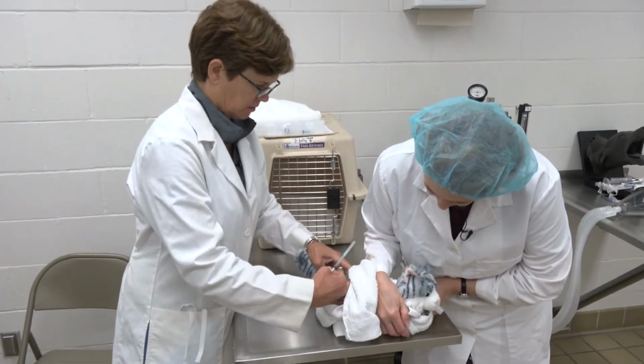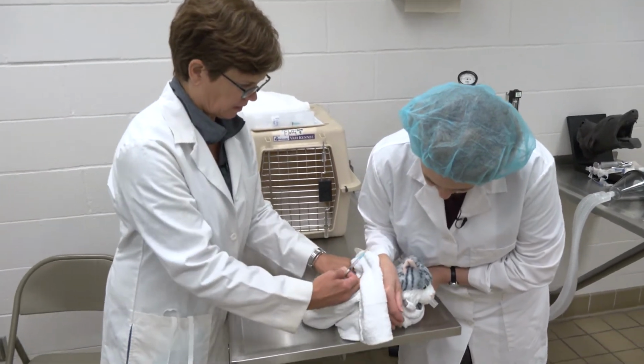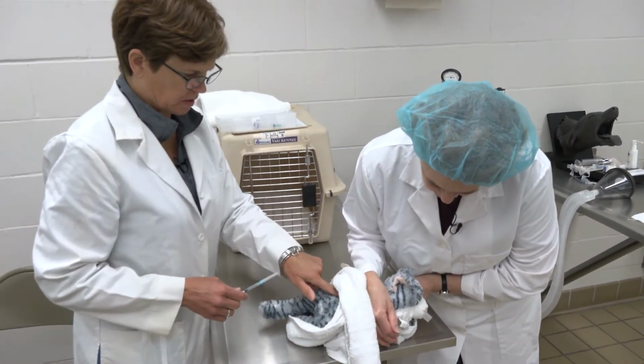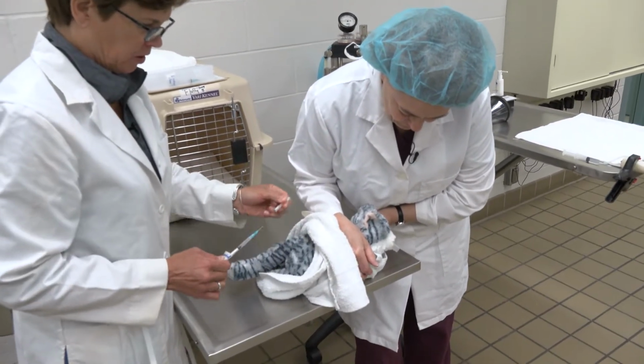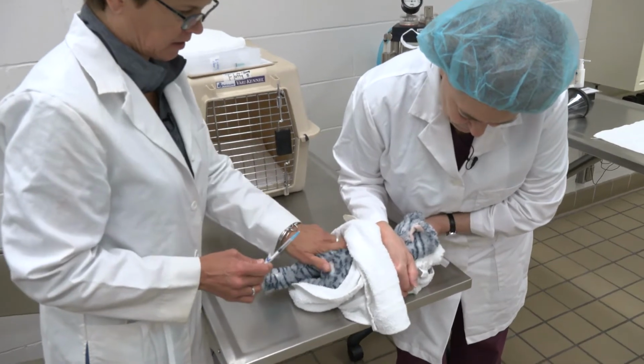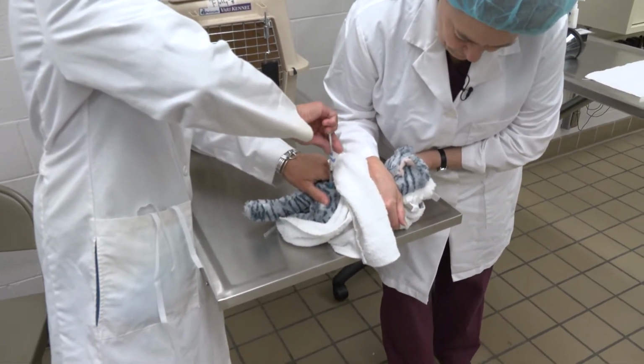Okay, I've got the kitty. Are you ready? Nope. You need a little more room. You don't want to pull too hard. So I'm going to use the back of the epaxial muscle group. I've got my pre-med. I'm going to use good syringe handling technique. Making my L, going in, aspirate, inject.